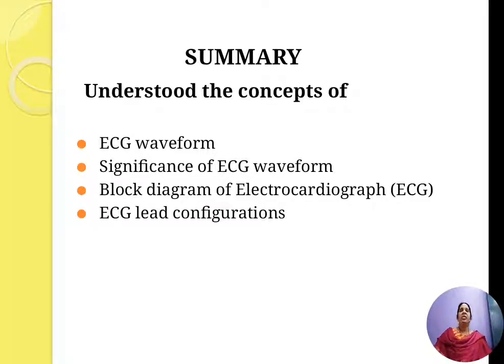The ECG recording setup consists of a patient cable and defibrillator protection circuit, then the lead selector switch, we have the calibrator, the bioamplifier, the auxiliary amplifier, isolated power supply, output unit and power switch. So the patient cable connects the different leads from the limbs of the body and the chest to the defibrillation protection circuit, which consists of a buffer amplifier and an overload protection circuit.